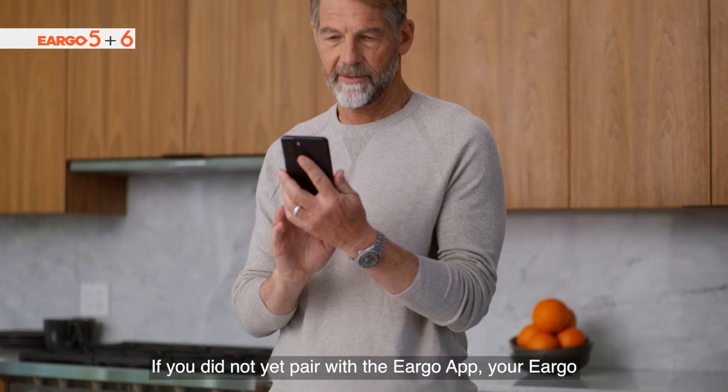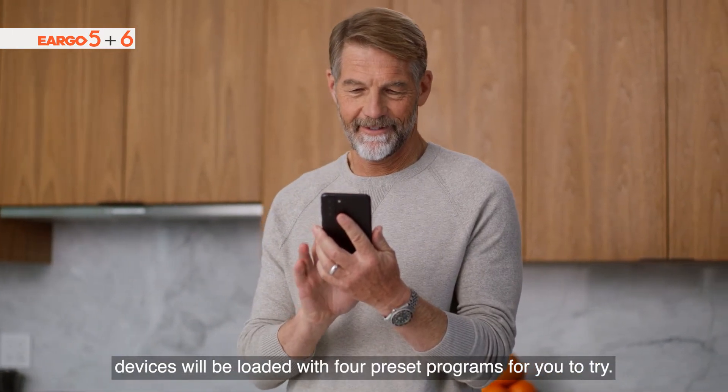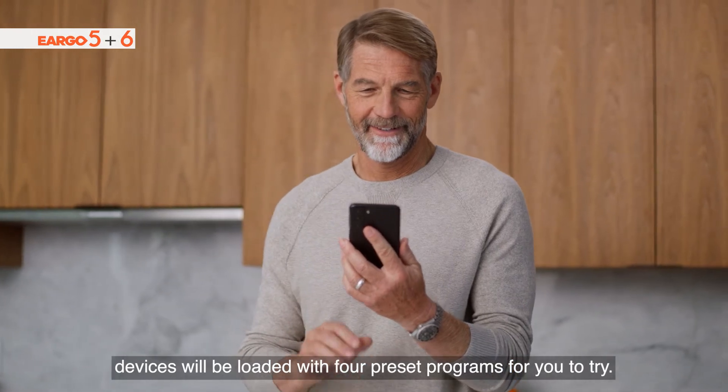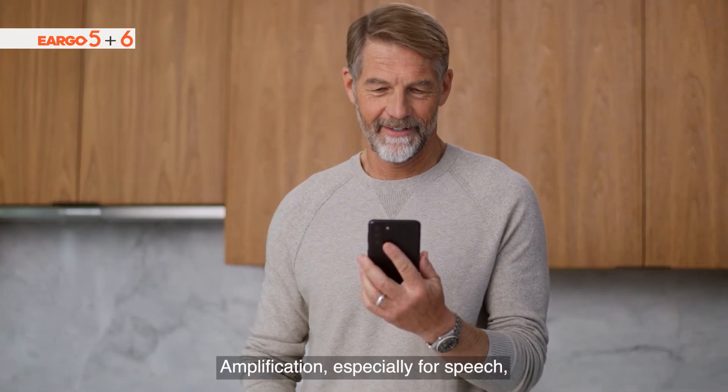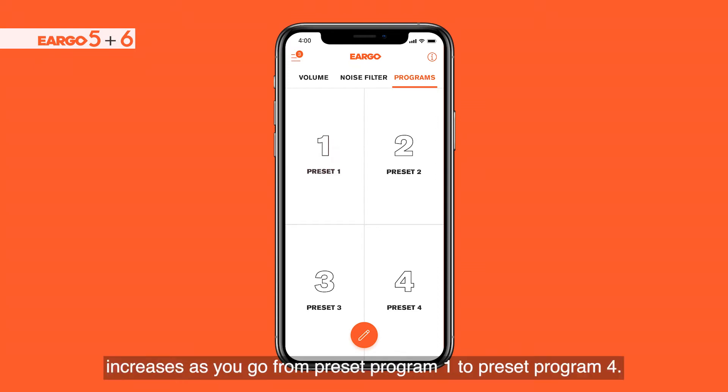If you did not yet pair with the Eargo app, your Eargo devices will be loaded with four preset programs for you to try. Amplification, especially for speech, increases as you go from preset program 1 to preset program 4.